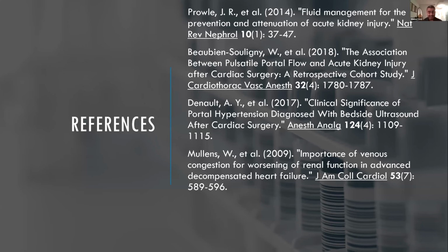Thanks. Great, no, great questions. So the first one, as far as the device, when you're doing a full cardiac echo, the better the device, the better. But for IVC, you don't need that advanced of a device, and portable devices are usually good enough. Now, the caveat is that the device needs to have Doppler if you want to be able to do the other things like the portal vein, the hepatic vein, and the renal vein. So Doppler is necessary. But all the newer portable devices are starting to add Doppler. I think in the next 5 years, every portable device will have some Doppler features as well, and going forward a portable device will be enough to do these studies.